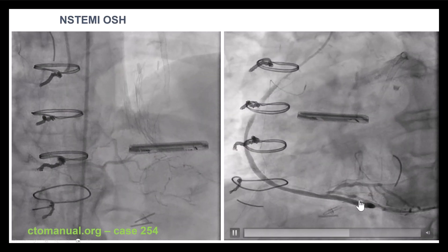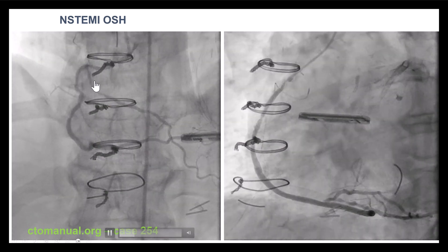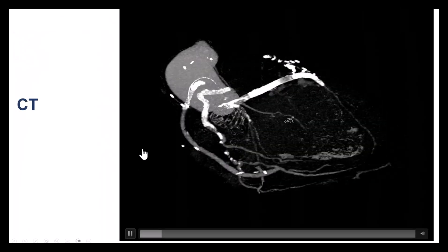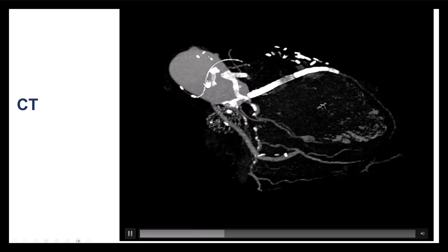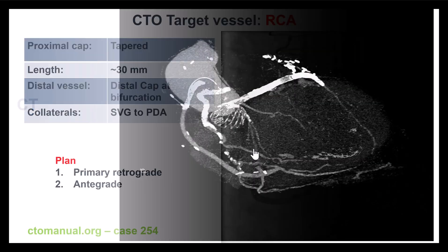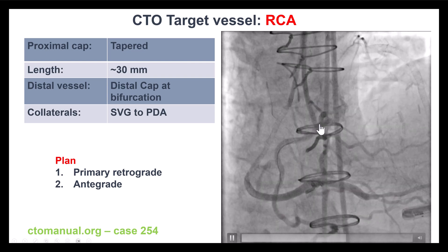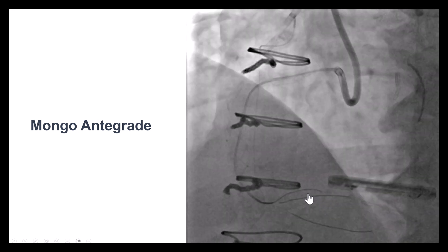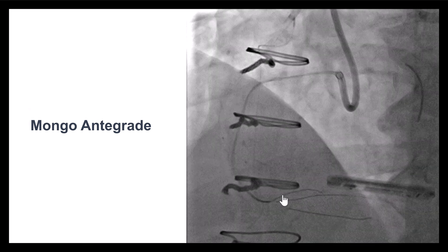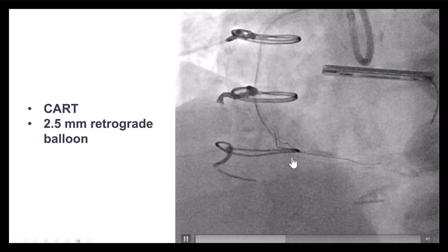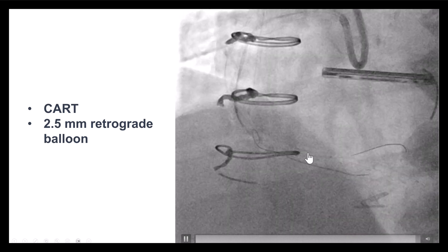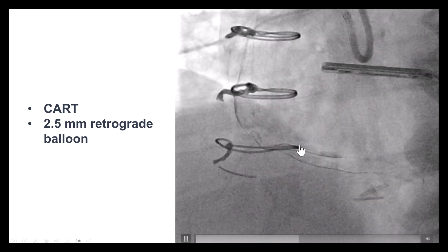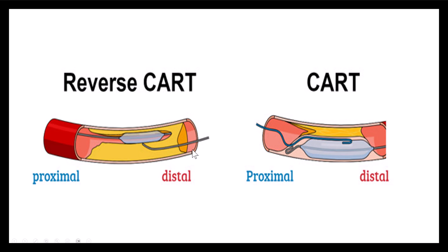This is a patient with a saphenous vein graft going to the PDA, a native right coronary artery CTO, and heavy calcification in the native right coronary artery. We see the bypass graft that has a previously placed stent that has been failing. We planned to go retrograde to recanalize the distal right coronary artery. We delivered an antegrade balloon but had difficulty making the two wires match. Eventually, we delivered a retrograde balloon, inflated it, and that enabled the antegrade wire to cross through — this is the CART technique. Reverse CART is when the balloon is advanced over the antegrade wire; CART is when the balloon is advanced over the retrograde guide wire. This is much easier to do through saphenous vein grafts than through septal or epicardial collaterals.